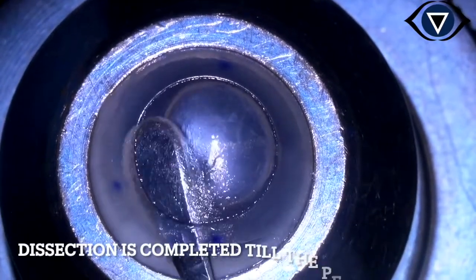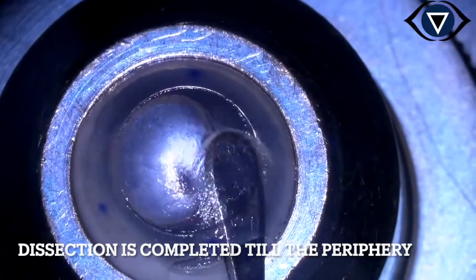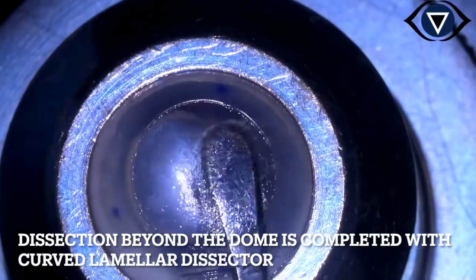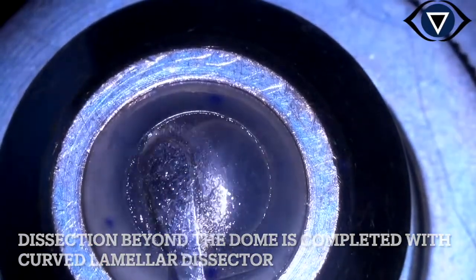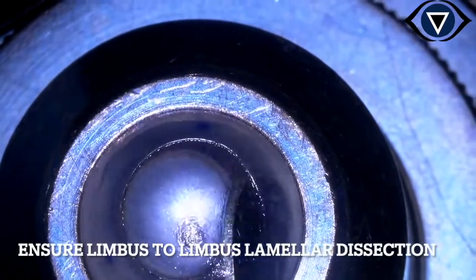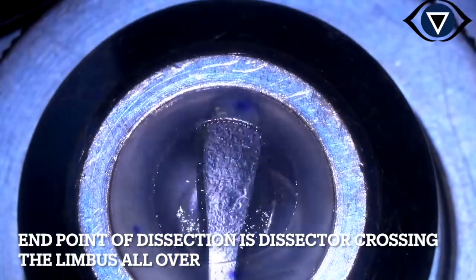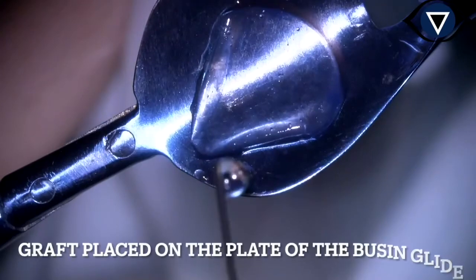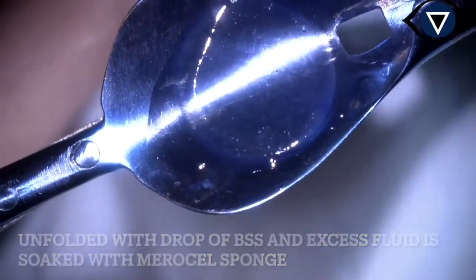In a similar manner, the dissection is completed till the periphery. After the dome of the cornea, the dissection is completed with a curved lamellar dissector. At the end, we have to ensure that limbus to limbus lamellar dissection is complete. At the end of dissection, the curved dissector is moved in all directions to ensure it crosses the limbus in all directions. This lenticule was then implanted in a patient of post-penetrating keratoplasty graft edema, where the surgery was performed like a normal DSEK surgery.